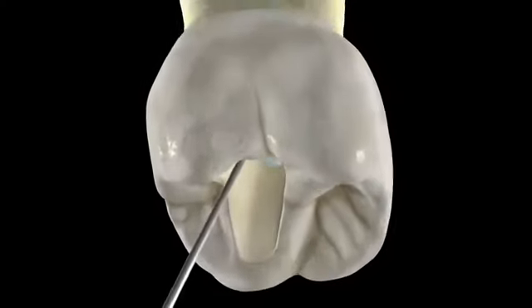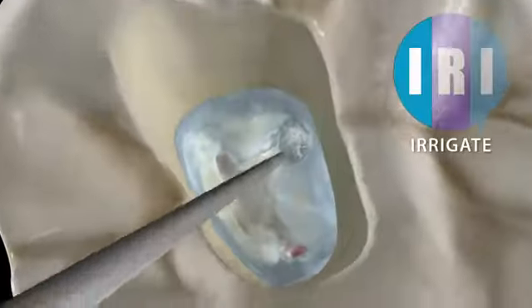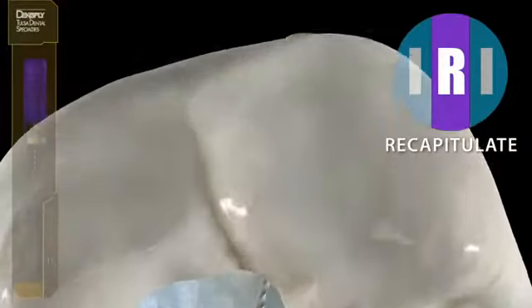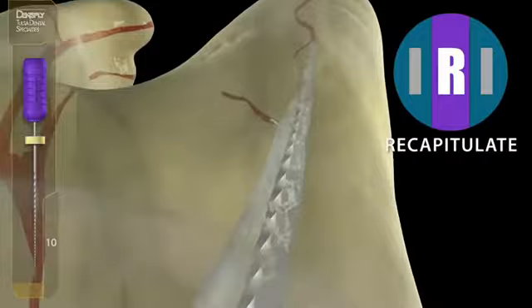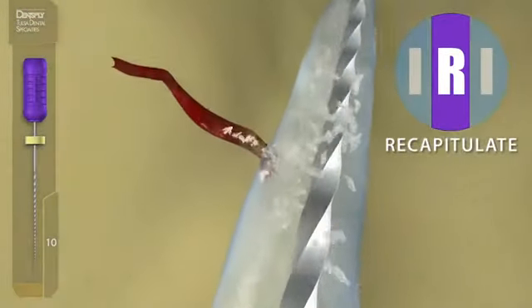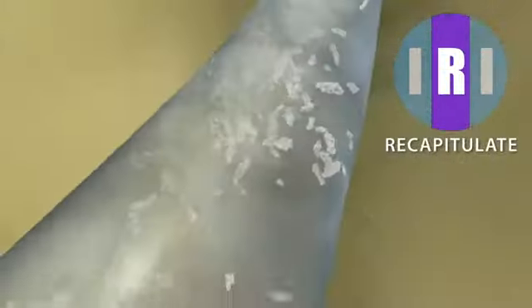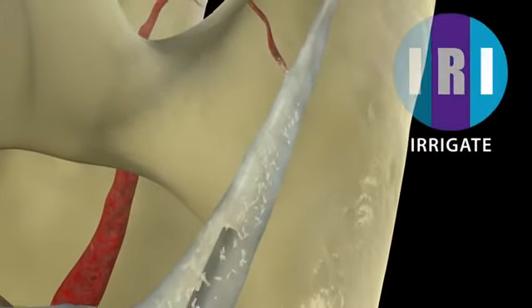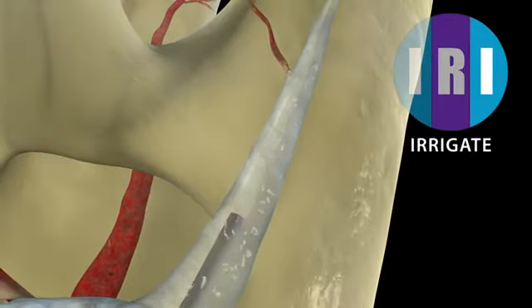Step 2 is to irrigate with full strength sodium hypochlorite, which will put any dentin mud into suspension so we can easily recapitulate and remove it. Remember, dentin mud and collagen are the fatal flaws of endodontics. Sodium hypochlorite will digest detached collagen, and so irrigation is an absolute must, and you can't do enough of it.